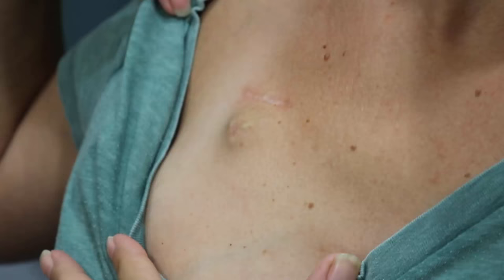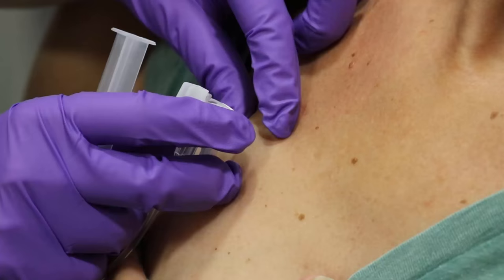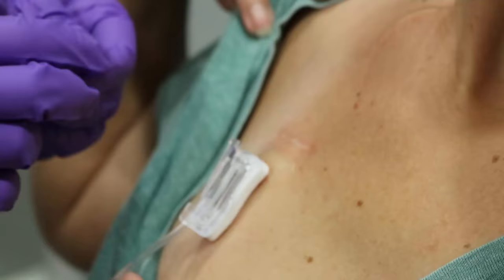Occasionally, you may be asked to wear a mask, especially if you cannot turn your head or if you are coughing and sneezing. You may be asked to take in a deep breath and let it out. The needle is then inserted through your skin and into the port. You may feel a slight prick when the needle enters your skin.